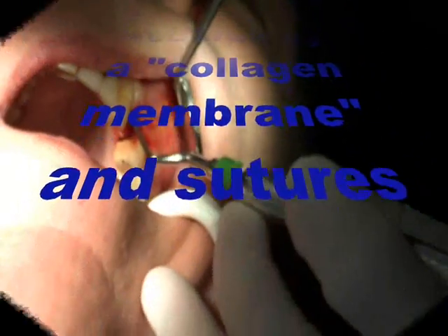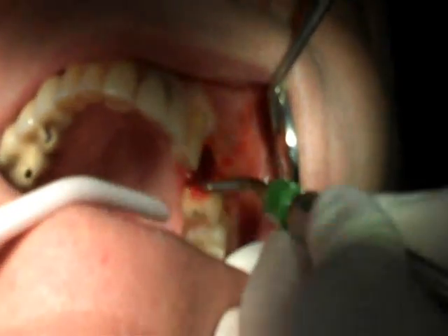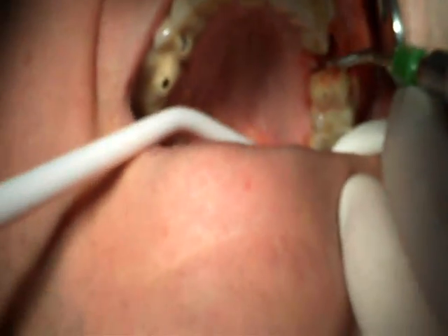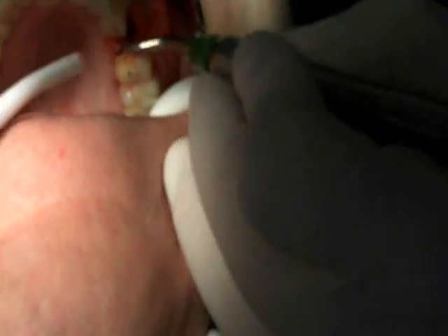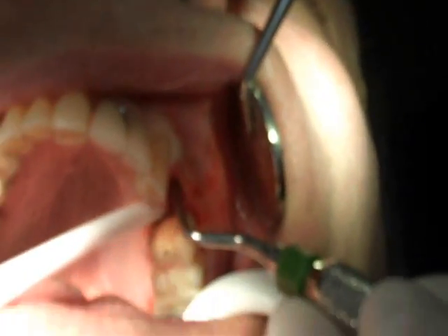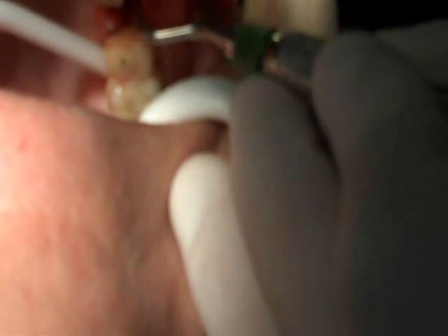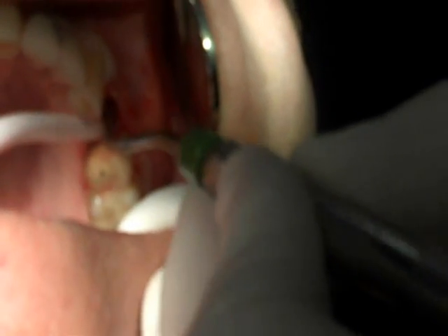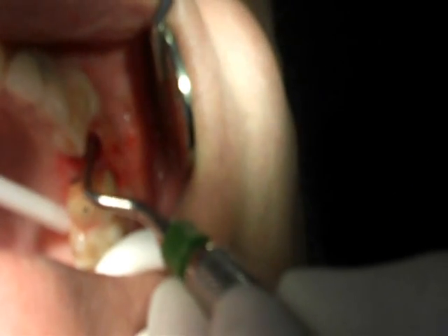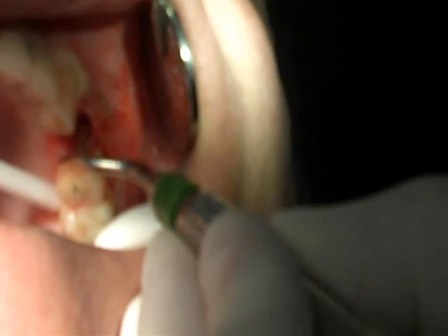At this point, I'm going to start cleaning this area out a little bit. You can see that where my instrument goes here, there is really complete loss of the bony structure around the tooth due to the gum disease. There should be bone here in this area, but there is none.